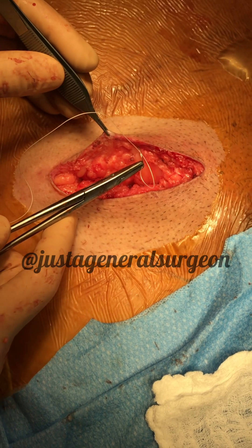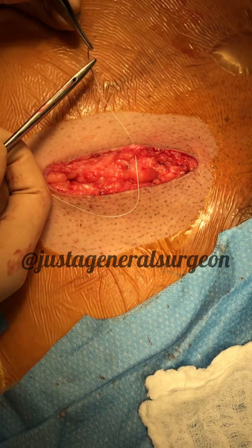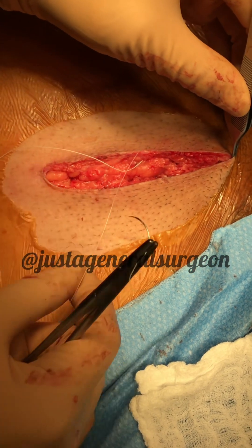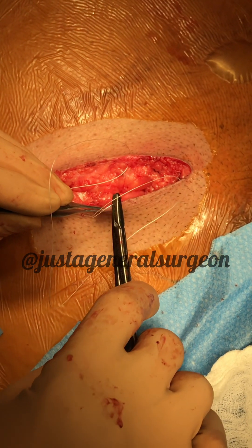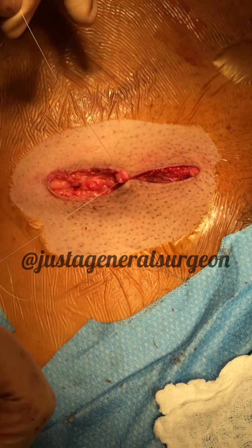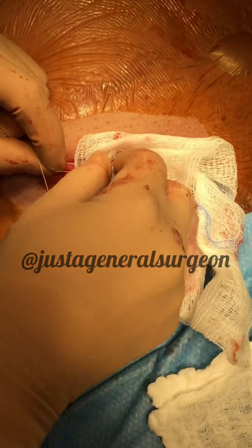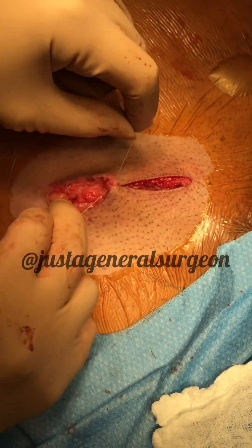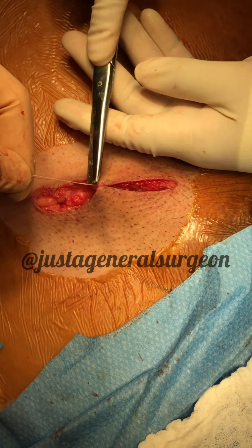We're going to go from deep to superficial right at the dermal-epidermal junction on one side. I'll pull on the corner to match up on the other side, then go superficial-to-deep. I'm going to have her cut right on the knot, because this will be a buried suture.